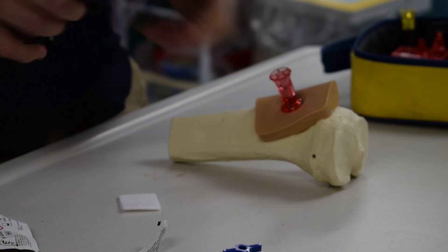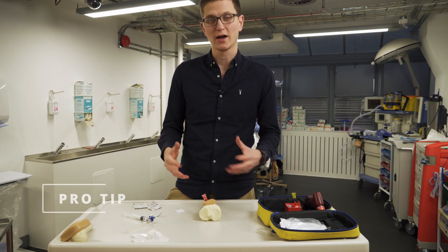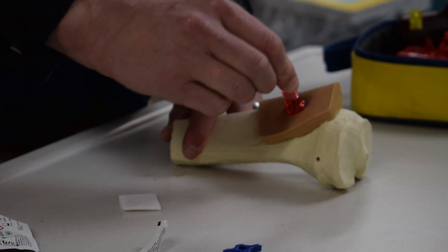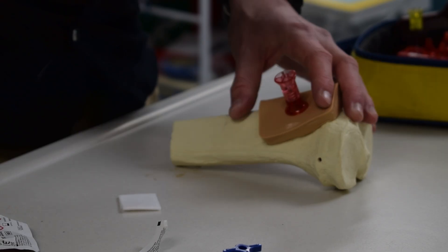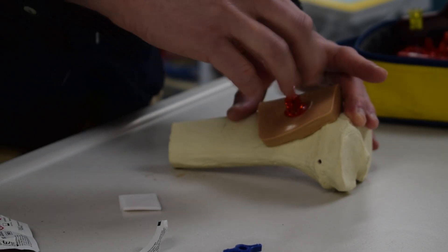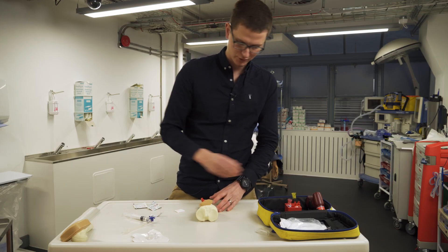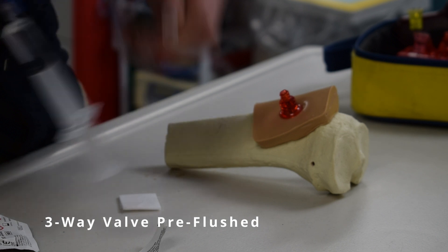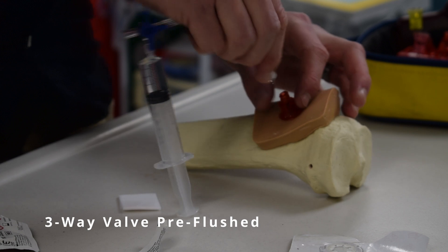And that's in. Now that it's in, the best way to confirm it's actually in the bone and not just in skin is that when you move the top of the needle, the whole bone moves. When the patient moves their leg, it moves - it becomes a part of the bone because it is in the bone. The stylet is then taken out and thrown in the sharps container. Now we're going to test that it's in the right place - I want to test that it's working before I tie it down.